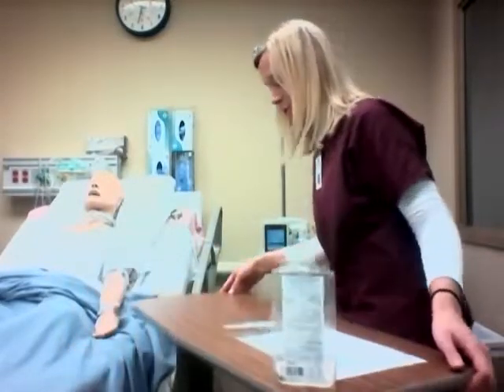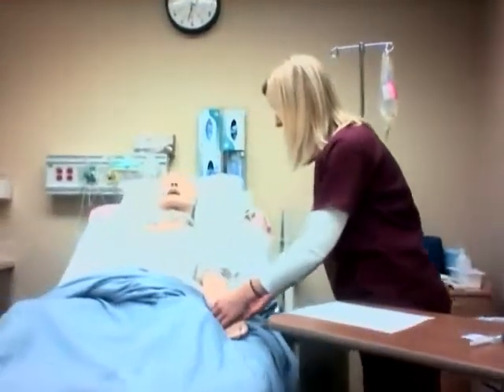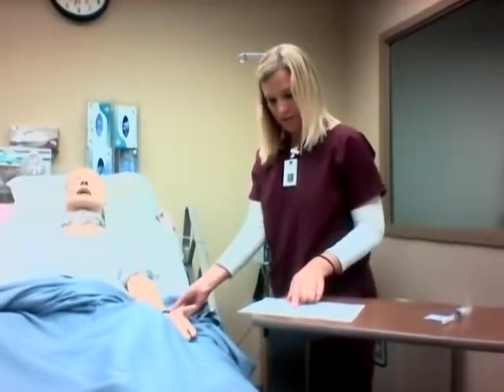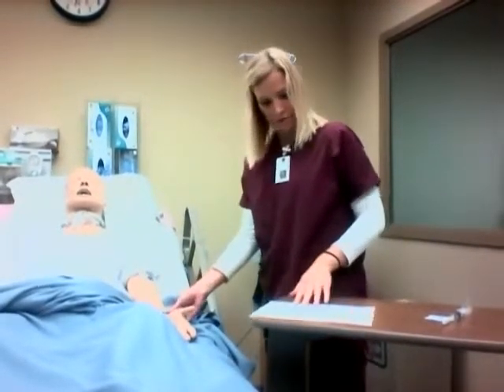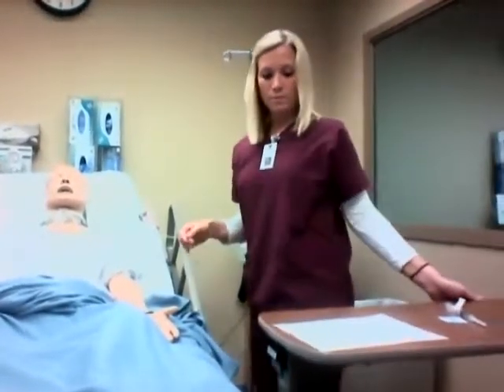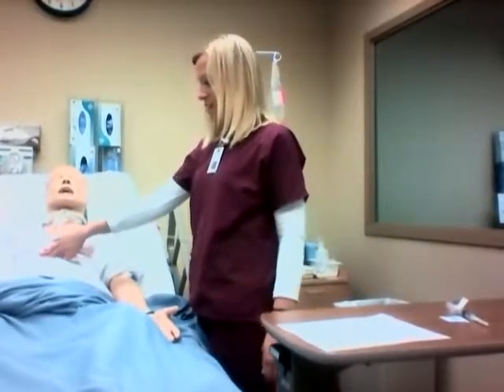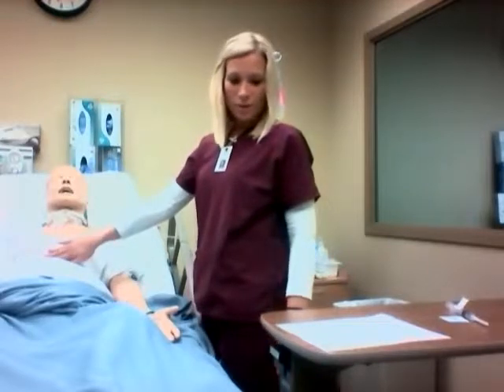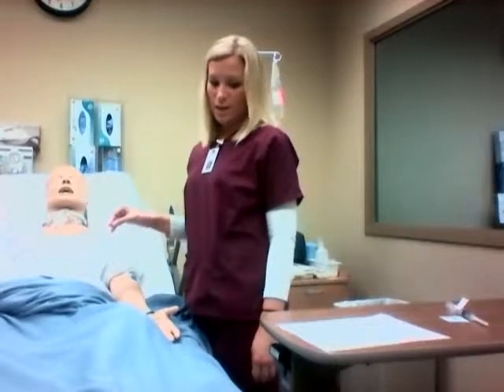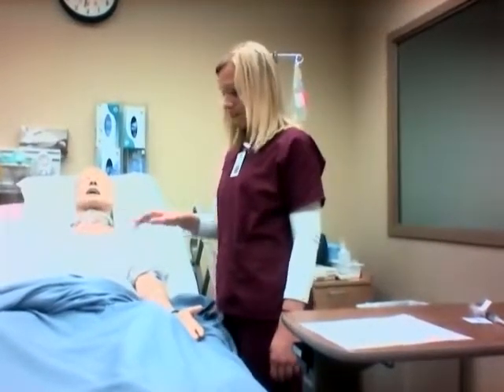Before I do anything, I'm going to check your wristband, just make sure everything looks correct. So can you tell me your name? And then your birthday is, okay, December 16th, thank you. And before I also do that, I'm going to check your vitals. I'm going to check your apical pulse and make sure that it's not less than 50. And then I would also check her blood pressure and make sure that she's monitored by the EKG. So it looks like she has all of her EKG wires connected correctly.